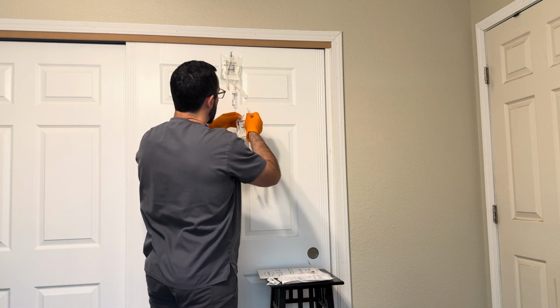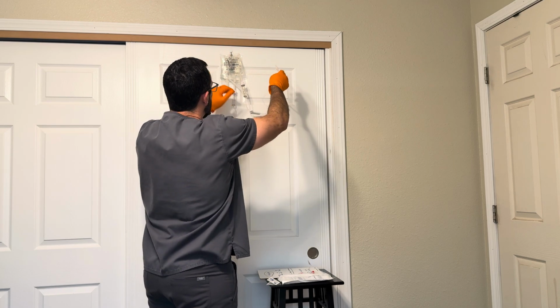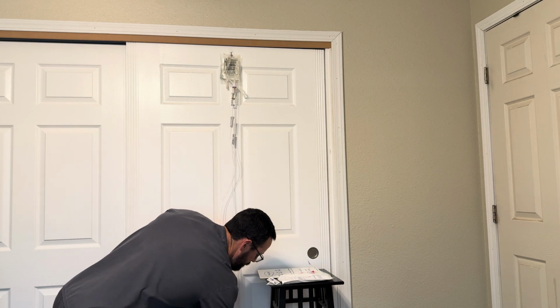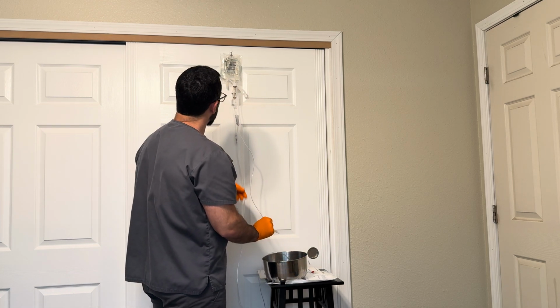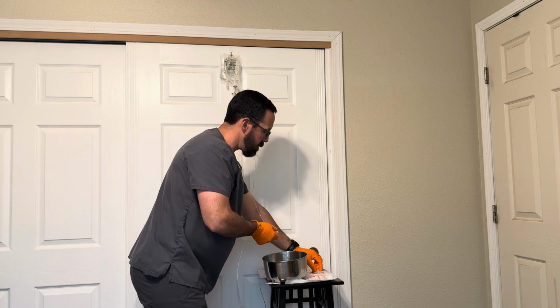So what I'm going to do here, hang this while I prime. My cap.